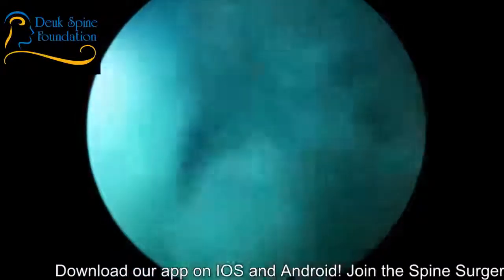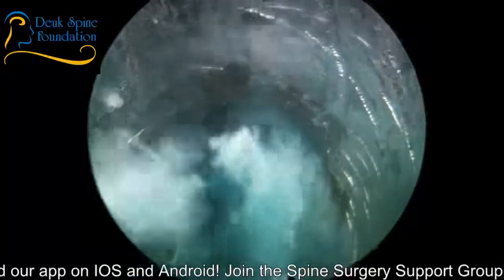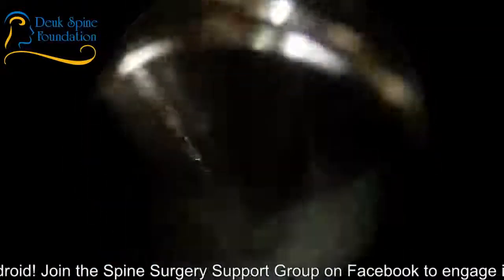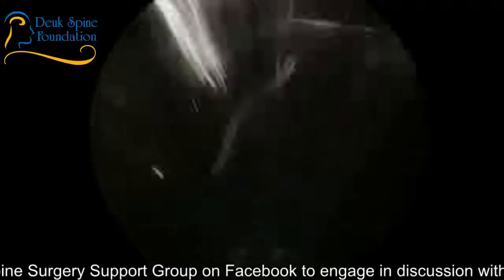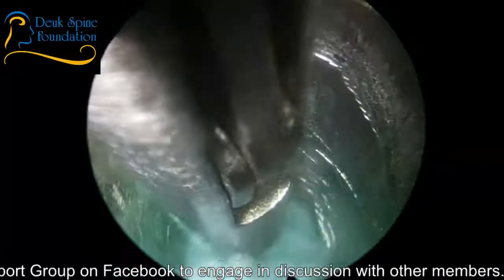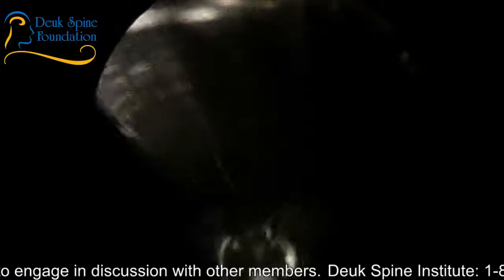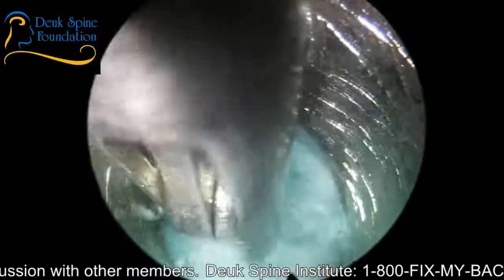I have a question. Yes. One of the viewers says, when Dr. Deuk injected the dyed L5S1, he said it went right in. Does that indicate that the disc at this level did not contain the dye and has substantial fissures? Yes, it indicated there were huge fissures and that the dye just leaked out, basically. So it did still contain some of it, but a lot of it just leaked out through the tears, the fissures. I didn't get to really pressurize the disc at all to elicit a painful response because everything just leaked out.